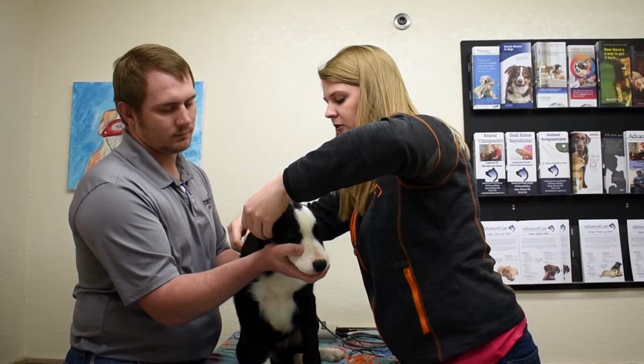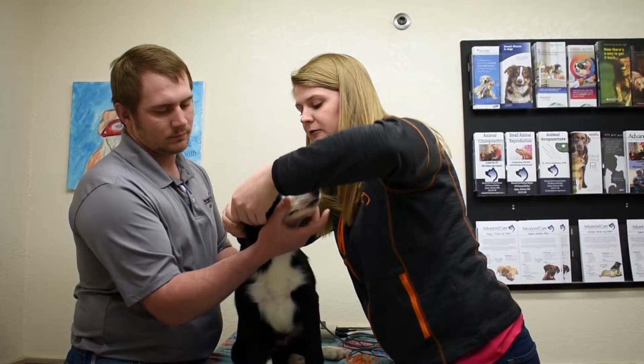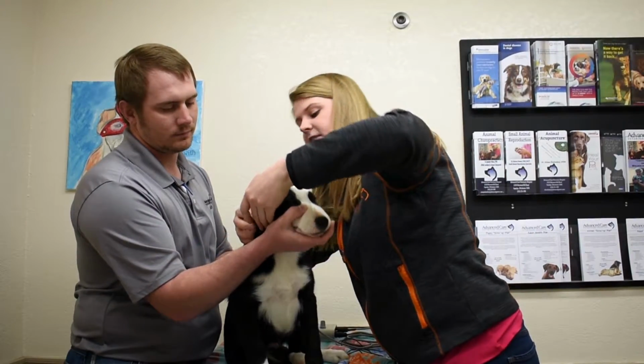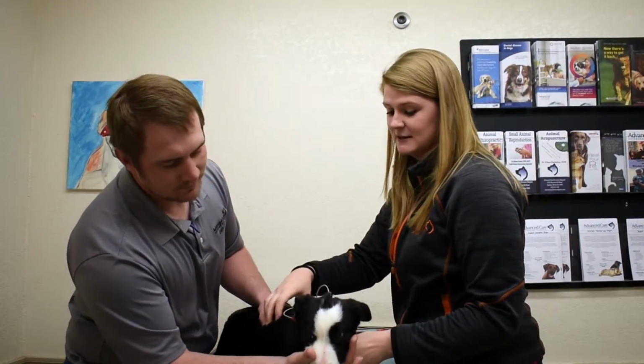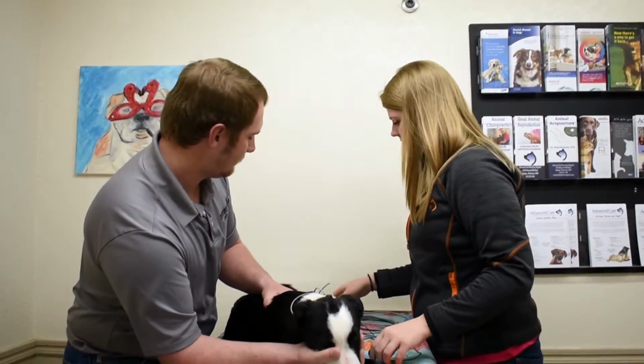So some puppies will use baby food, so frozen baby food can keep them preoccupied. It's actually the same technique that we use in acupuncture. I stole it from Dr. Huckabee. It seems to work pretty well. All right, so he's all hooked up now.